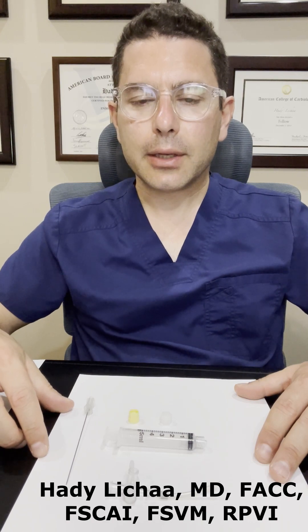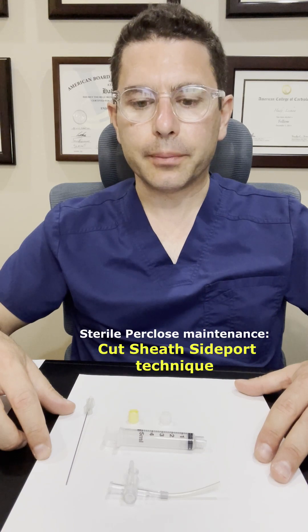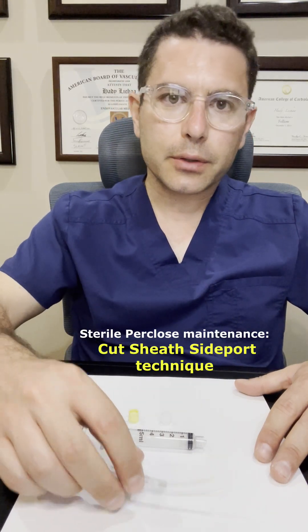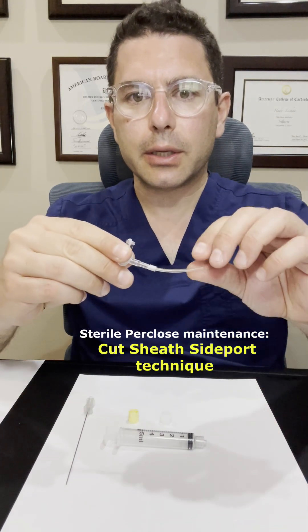Going over another sterile technique to maintain the perclose suture sterile while the patient has an indwelling large-bore sheath getting out of the cath lab to the CCU or ICU. This is the sheath side port technique, the cut sheath side port technique.